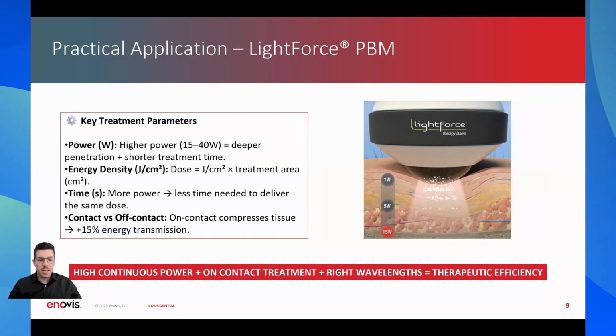It is important to make a good calculation of the dose to avoid underdosing or overdosing. Therefore, it is also recommended to use the calculation tool provided by the software itself to calculate the dose and thus ensure correct dosing. The time will depend directly on the dose and the selected power. The higher the power, the less time is needed to apply the same dose.